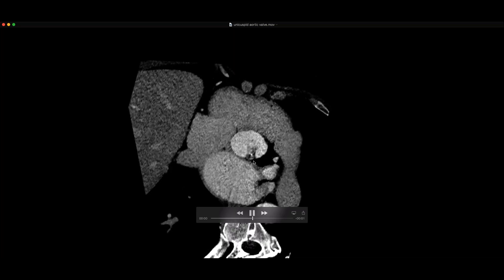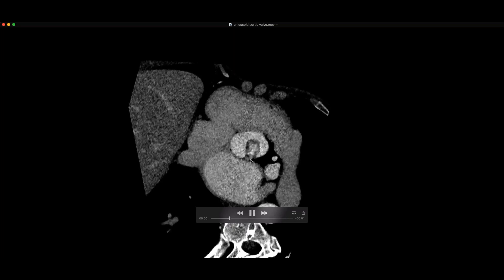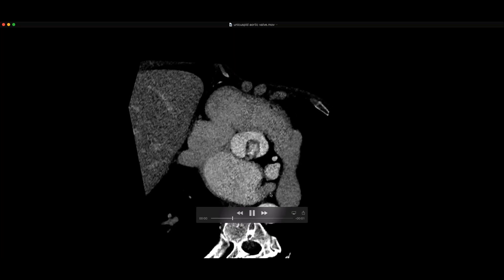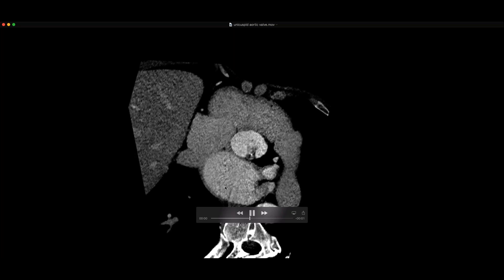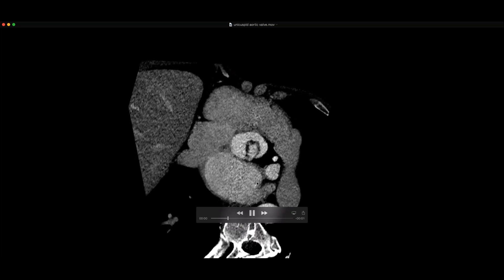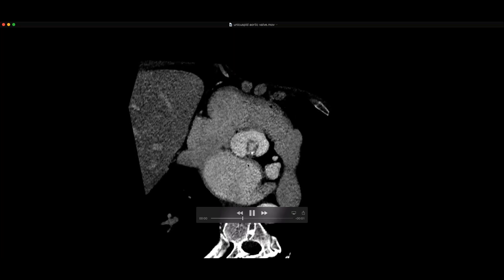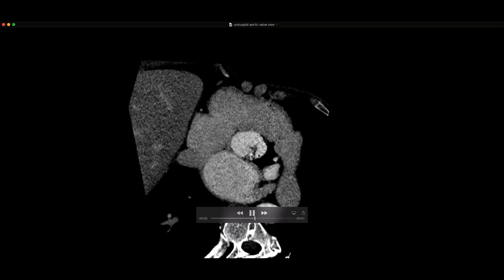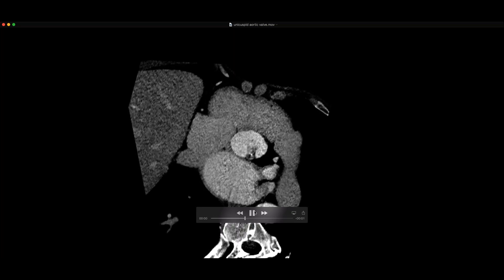These unicuspid valves tend to develop aortic stenosis relatively early. This was on a TAVR planning CT. The question was whether they could possibly do TAVR here, or would placing a valve over this somehow rupture things. Apparently they're going to go ahead and do it — they've done it before. They used to have a preference not doing TAVR on bicuspid and unicuspid valves, but now more and more they're doing TAVR in those valves.